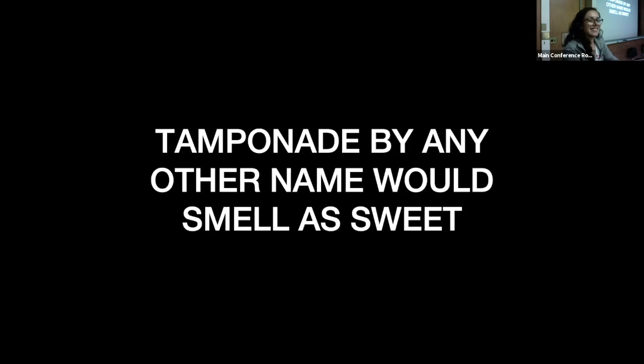You're doing ultrasound early, great. We identify tamponade there so that you can get them to surgery, so they can get that much safer window in the OR, versus the small select group that actually needs emergent pericardiocentesis in the ER, which is a much smaller subset. If you look at our role in the ER, each one is incredibly valuable. Like finding those people who aren't just able to go to the floor and identifying that tamponade is real. They're just not in super tamponade that I have to intervene at the second right now.